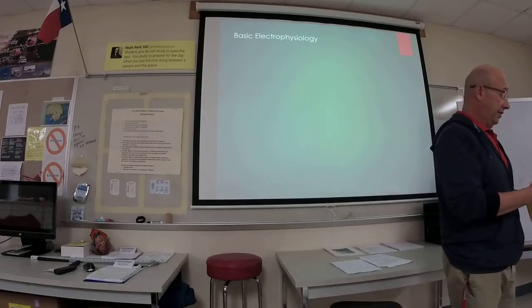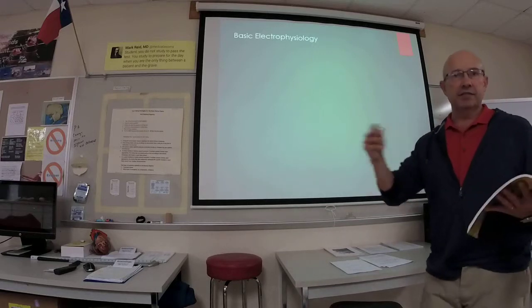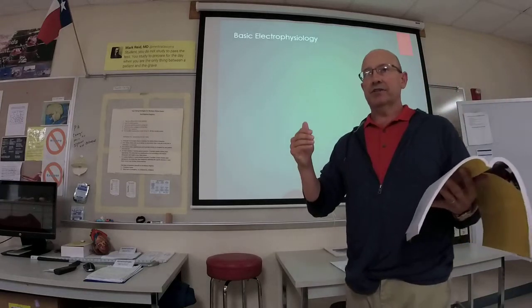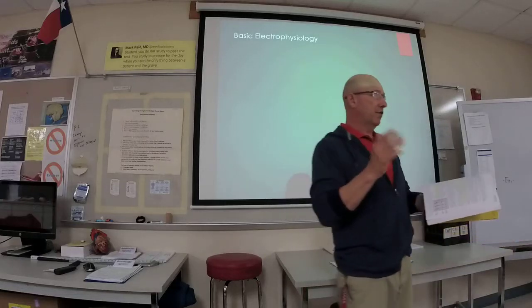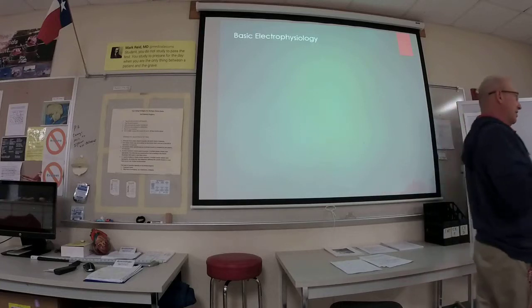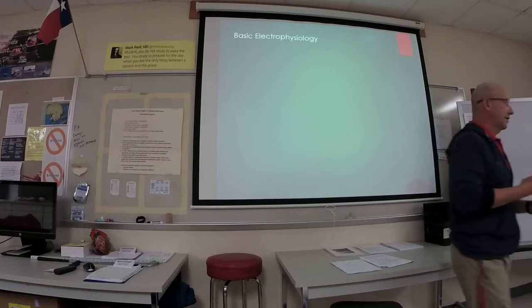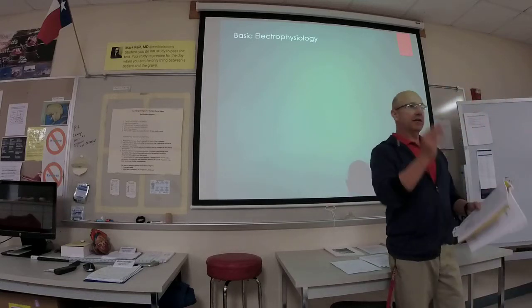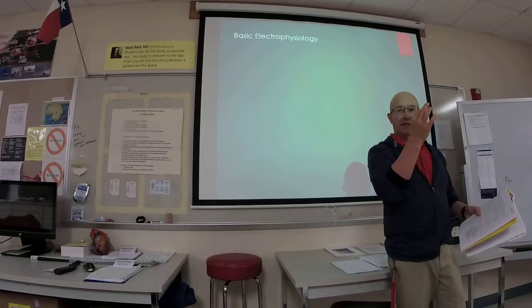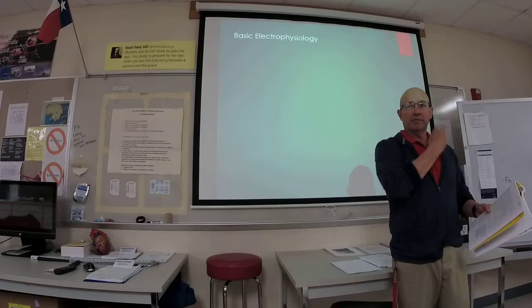We already know there's the equipment. When you go to do an EKG, make sure you have all your equipment there. It's just poor form to have to run back and forth for equipment. Make sure it's clean. Clean it in between each patient contact, the cords and the electrodes. Make sure they're in good working order. The electrodes contain a gel on the top, a real sticky gel, and that's just a conductive jelly they put on the skin. Without it, you'd pick up a lot of artifacts.